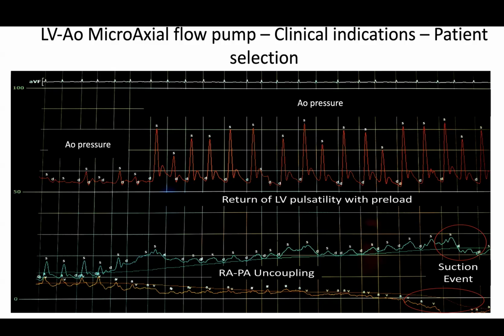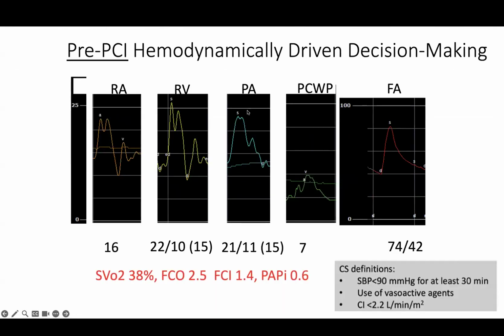We were always told that any acute MI shock is biventricular shock to begin with, because you have septum involvement and whatnot. So I think this is a really nice example of how hemodynamics can guide you. When I saw my attending asking for an RP Impella for this case, I was literally shocked about it.